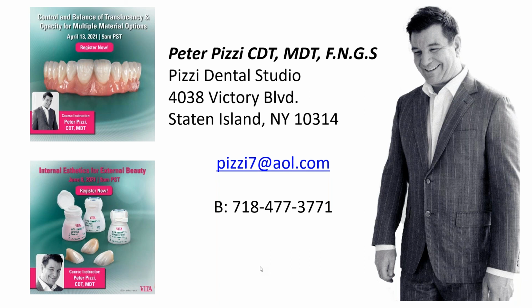Do I always ask my dentist for a polarized photo, or should I? I think the polarized photo is most important in single or two-tooth dentistry when you're really trying to match something specifically. Utilizing it more doesn't hurt because it just gives us more information. But honestly, once you get past 6 or 8 teeth, I'd say it's just a wasted photo, right? Because you're kind of creating your own at that point. So for me, it's most specific in the 1 or 2 kind of restorations.